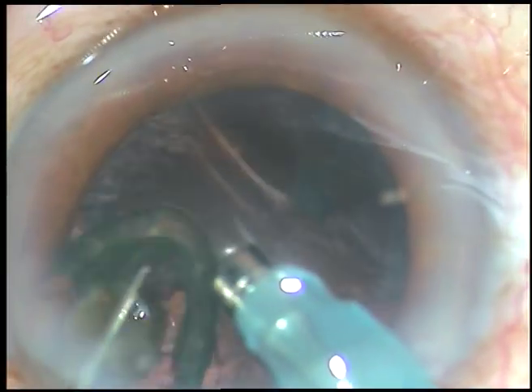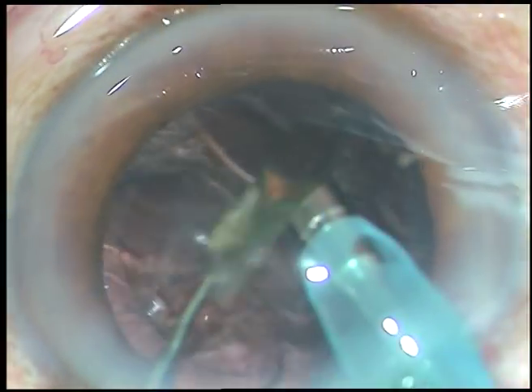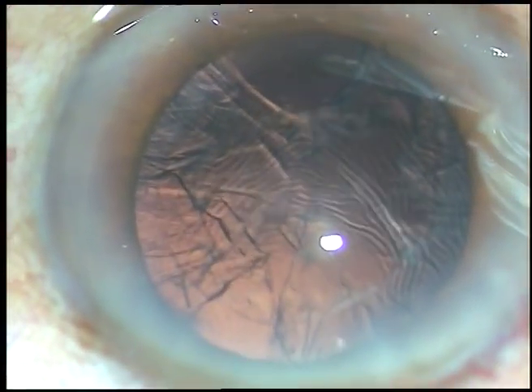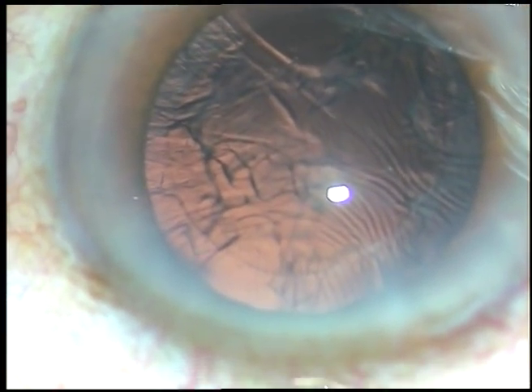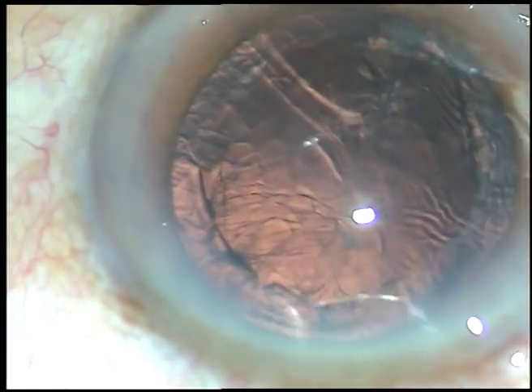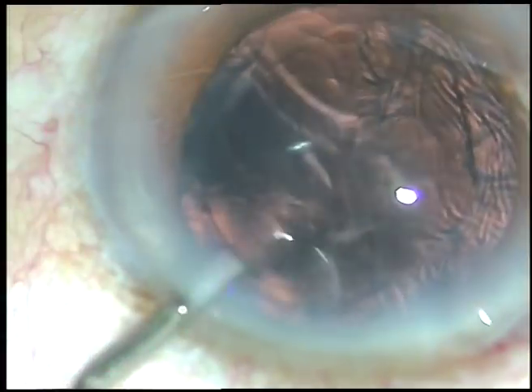During the last portion of the nucleus, be very careful of the anterior chamber stability. Inject some viscoelastic substance to manage the nucleus safely.